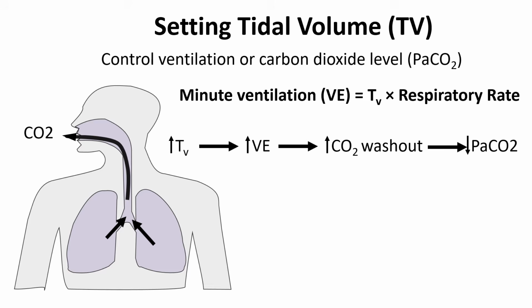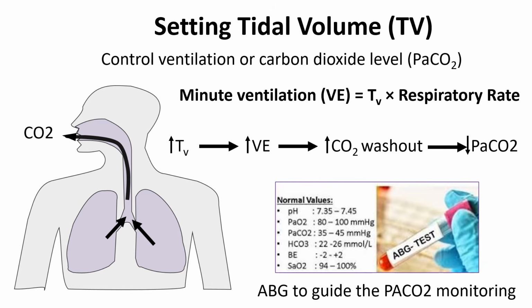However, it is important to be cautious when adjusting tidal volume, as excessively high settings can result in ventilator-induced lung injury. Regular monitoring of blood gas levels is essential to ensure the appropriate balance between ventilation and lung protection.